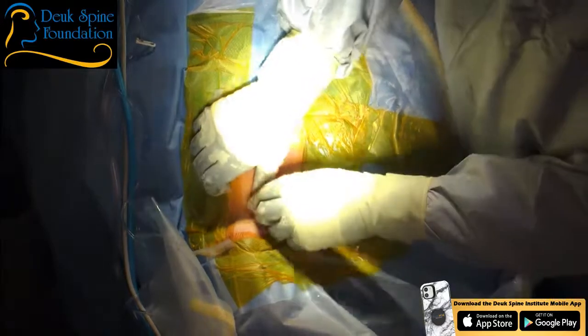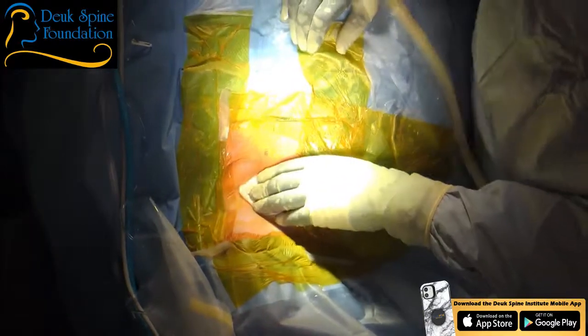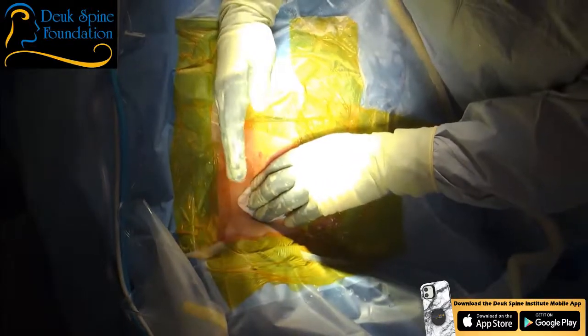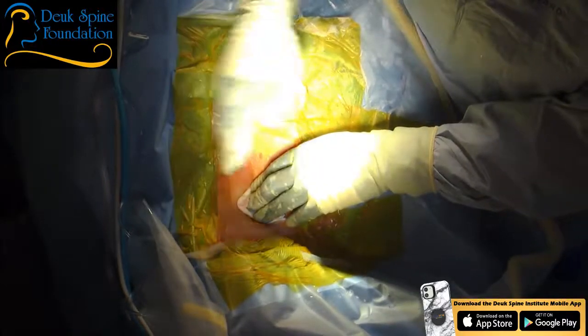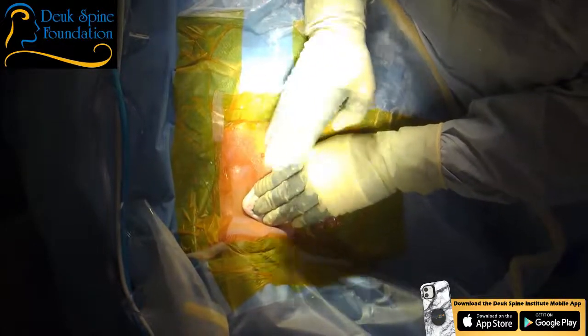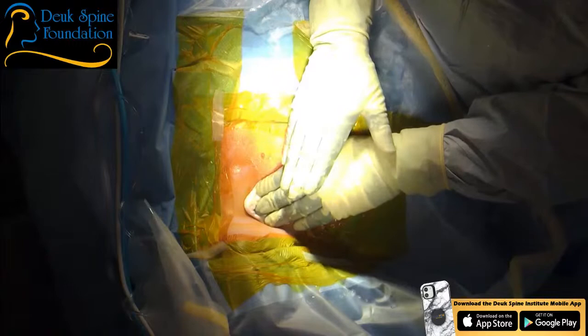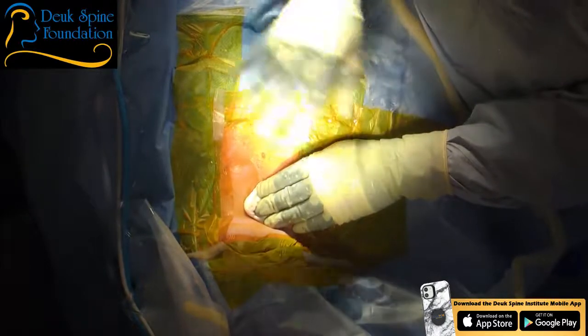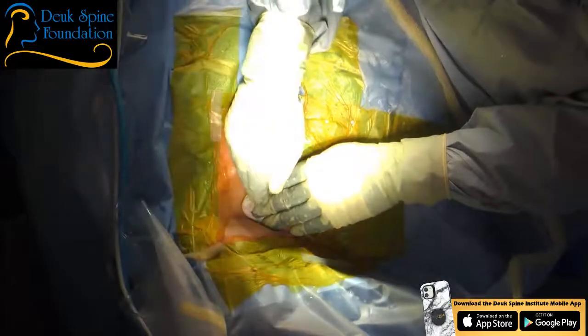All right, so can you see the neck here? Yes, we can. Because her symptoms, she's laying on her back looking up at you. Because her symptoms are on the left arm, we always go to the right side. So I always go on the side opposite of the patient's worst arm symptoms. So most of her symptoms are left arm, so I went to the right side of the neck.